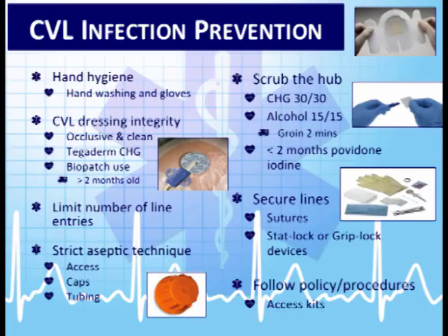Maybe the doctors can't get a central line into the internal jugular vein, and the groin is what they had to work with. Those, you want to scrub a little bit longer before accessing those if we would need to en route. Less than 2 months old is iodine, not the chlorhexidine. You don't want to use chlorhexidine on pediatric patients under 2 months old, the infants.